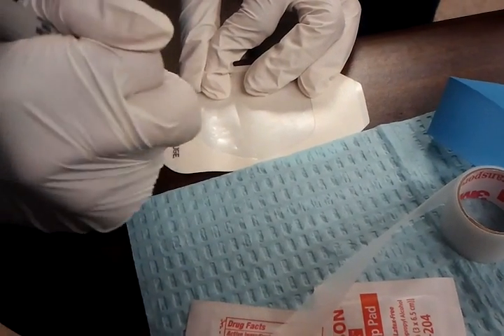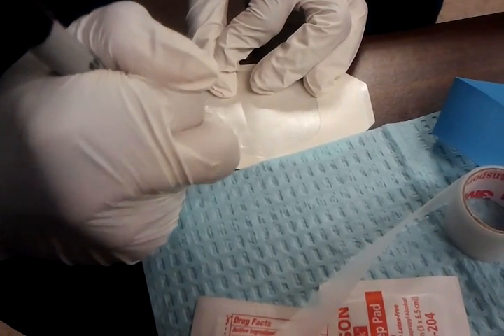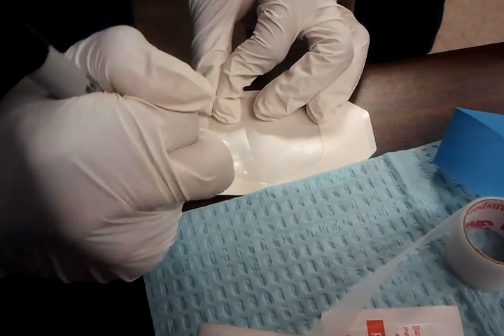Be sure to date, time, and initial your dressing and tubing.